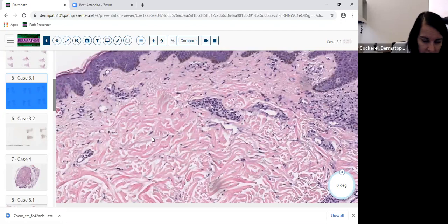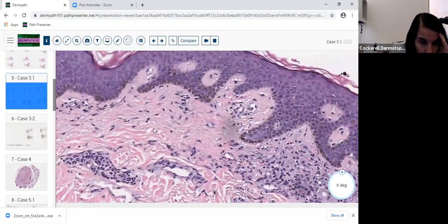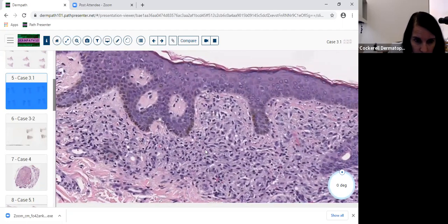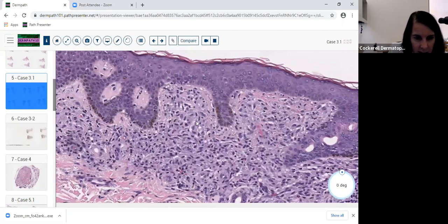So this was urticaria pigmentosa, where there was a perfect clinical pathologic correlation because we actually saw the clinical slide. The brownish lesions. Now, why are these lesions brownish? This is an important little fun fact. As you're honing in on whether this could be urticaria pigmentosa, you'll notice an increase in melanin in the basal layer. Somehow these mast cells activate the melanocytes to produce more melanin. So you'll have an increase in melanin in this basal layer, which explains the clinical appearance. So I wanted to bring that up really quickly.